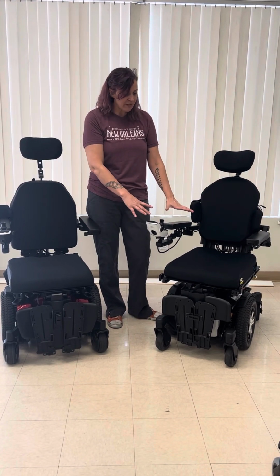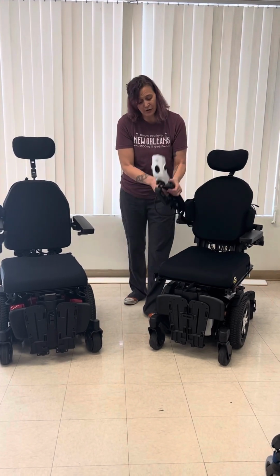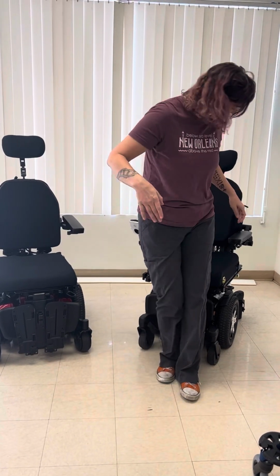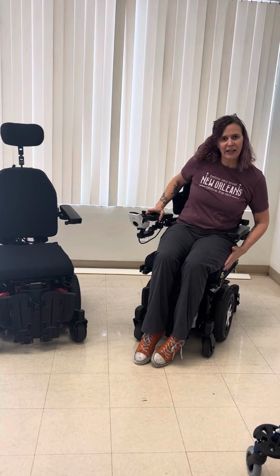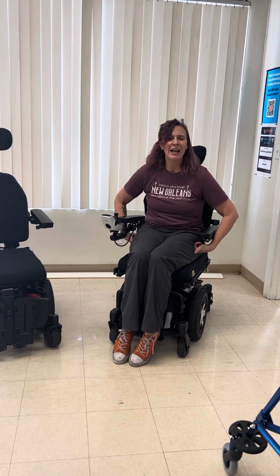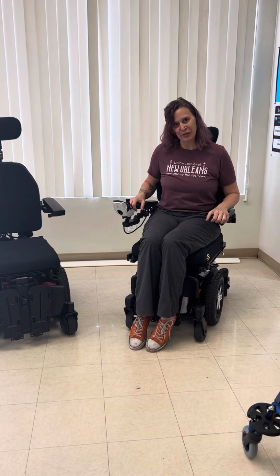For the benefit of this, even if your hips are a little wider than what we're talking about here, if you get the armrests like these that are the flip up, then there's no pressure on the side of your hips because there are lots of different armrests you can get. And so here you can see, if my hips are hanging outside the frame, then that's okay, right? Nothing's putting pressure. I'm not going to have any skin breakdown because there's this gap because the armrests go up and down. So that's something to consider.